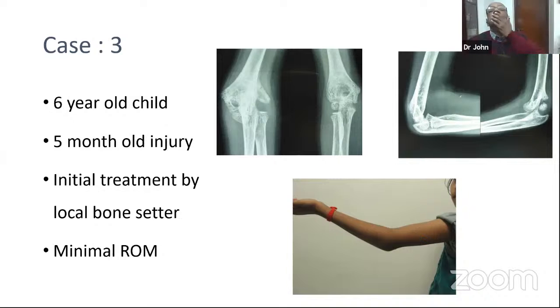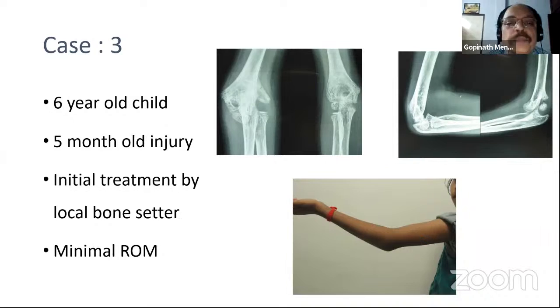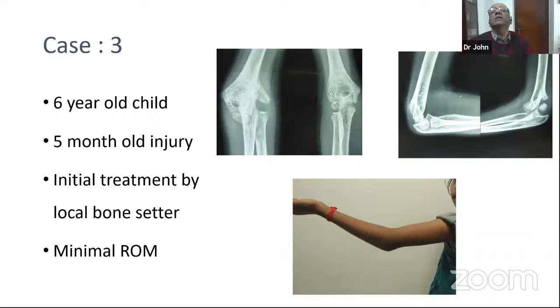Okay. Gopinath? I also think that there must be a fracture there because the capitulum is not articulating with the radius anyway. It's most probably a dislocation, yes. It's a lateral dislocation with myositis. Okay. Ramni, you have something to add to that? Yeah, I also feel it's a dislocation and there is some myositic mass there, definitely. Okay, so great. Okay, so what do you think this is? I'm sorry? Can you see my pointer? No. Okay. All right.